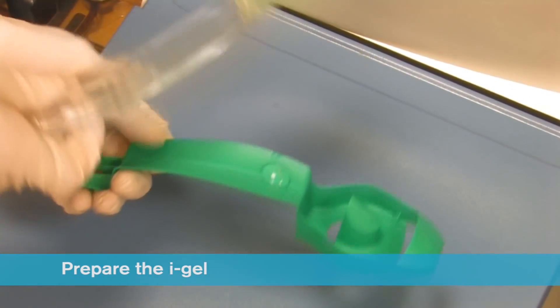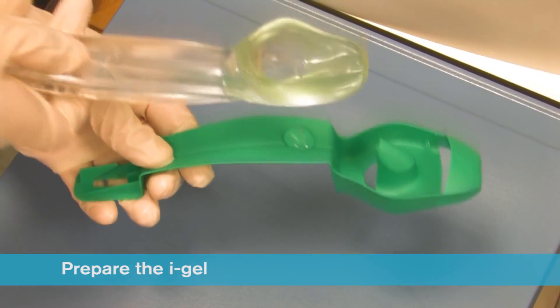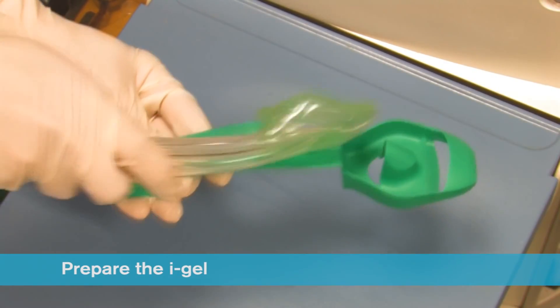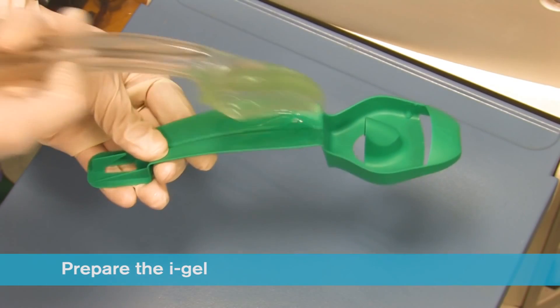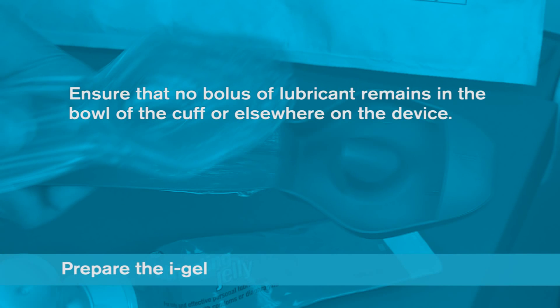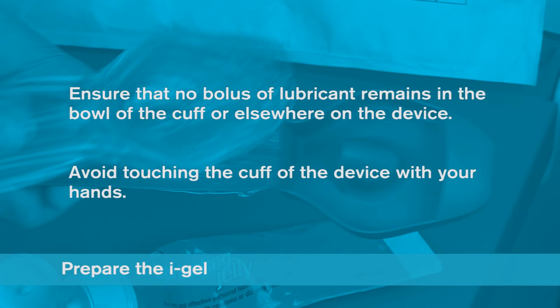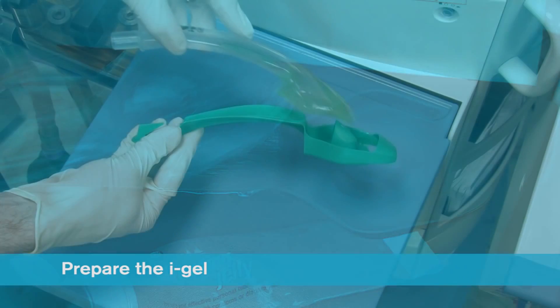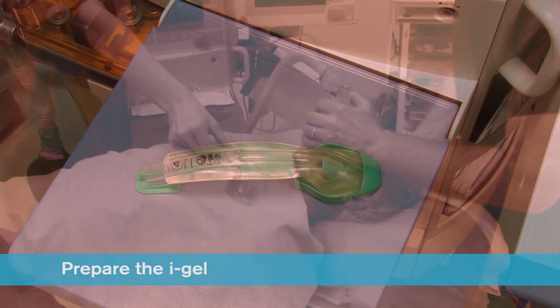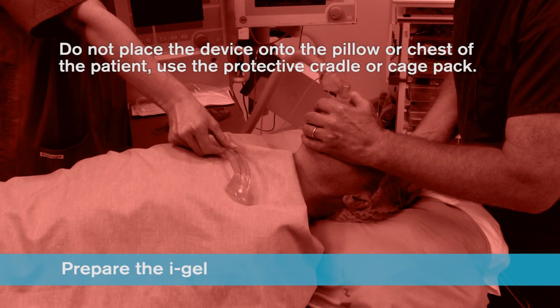Grasp the iGel with the opposite free hand along the integral bite block and lubricate the back, sides and front of the cuff with a thin layer of lubricant. This process may be repeated if lubrication is not adequate. After lubrication has been completed, check that no bolus of lubricant remains in the bowl of the cuff or elsewhere on the device. Avoid touching the cuff of the device with your hands. Place the iGel back into the protective cradle or cage pack in preparation for insertion. Do not place the device onto the pillow or chest of the patient. Always use the protective cradle or cage pack.